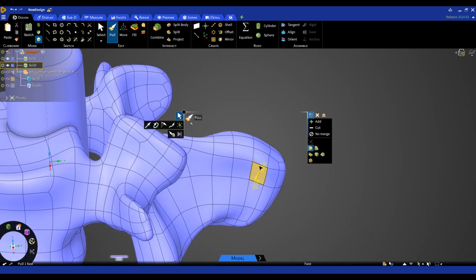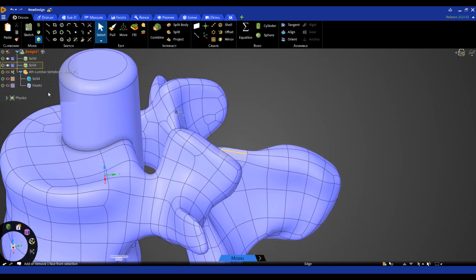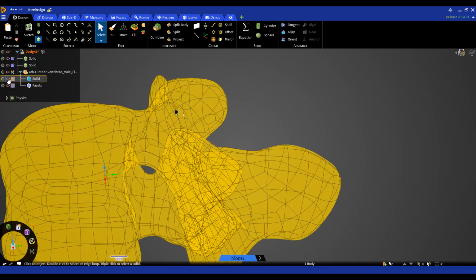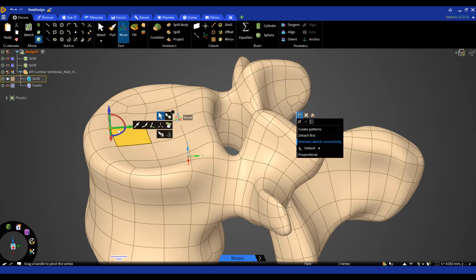What's really interesting about the SubD model is that if I'm doing a regular CAD model, you can see it's very difficult to make organic shapes like I have here with the bone type of geometry. But with a SubD model, I was able to modify the geometry. So here I'm trying to pull on this. It's trying to maintain continuity and basically is not allowing me to adjust the geometry. But if I hide my solid models, and turn on my SubD model, I can grab a single point here and move it around.